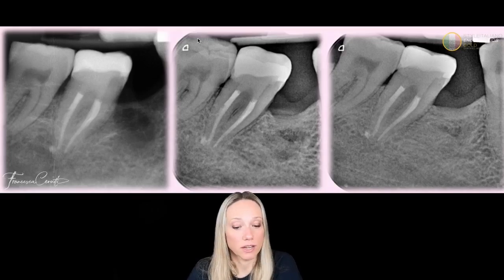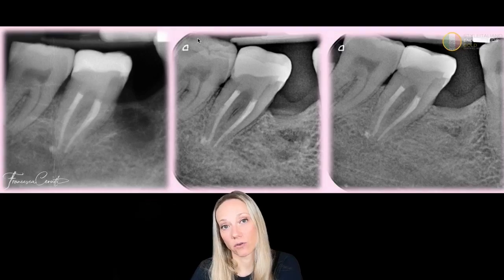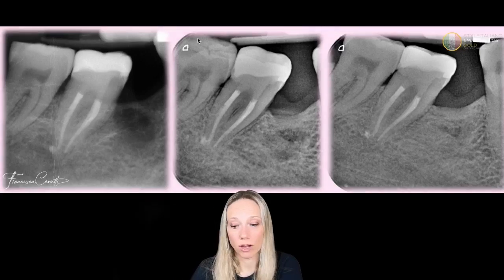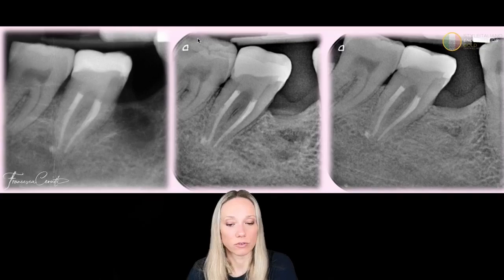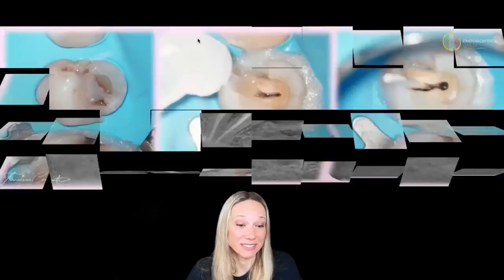And you see the follow-up at 2 years. Everything is working nicely. The patient has also had a surgery to remove the residual cyst that there was in the site of the first lower molar, and you see that it is healing over time, so I'm not cheating, and this is the result.